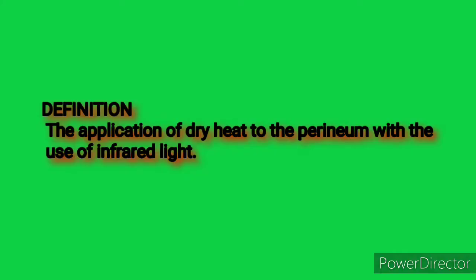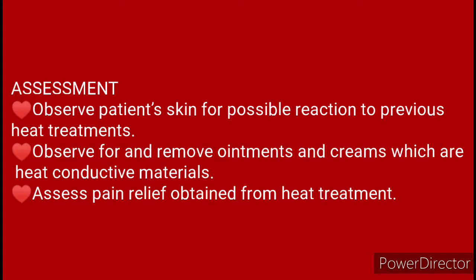Good day everyone, my name is Rachel Mahinay from Bees and Tree Lineager, and today I will be performing the Peri-Heat lamp application. What is lamp application? The application of dry heat to the perineum with the use of infrared light.